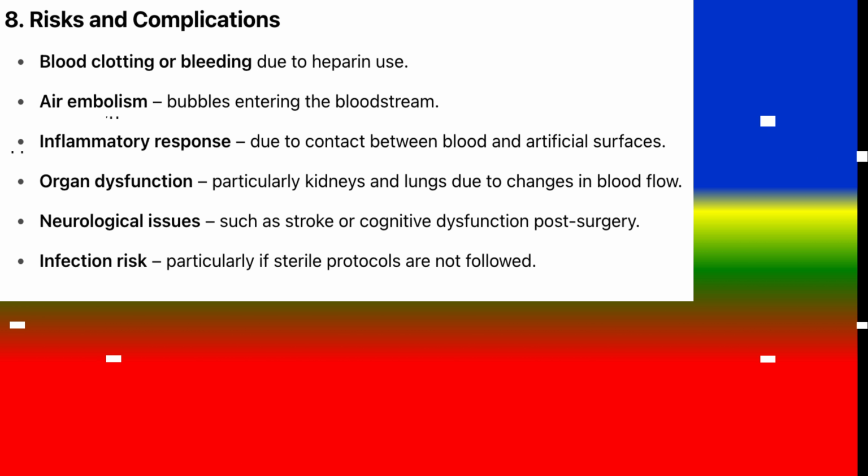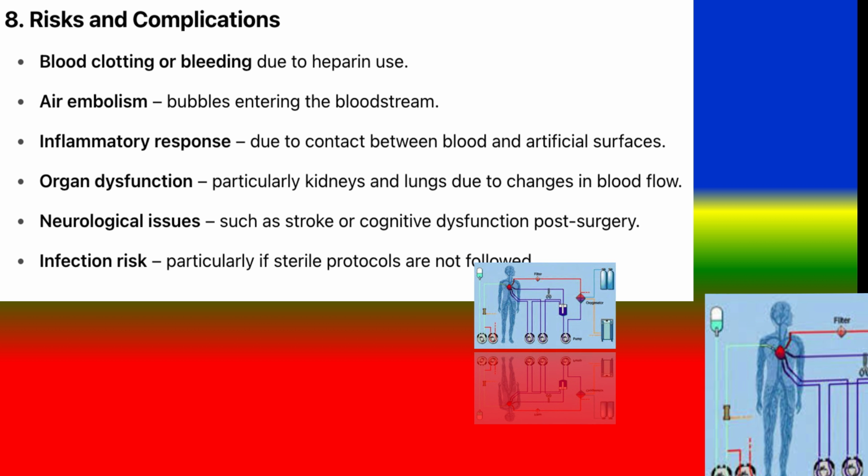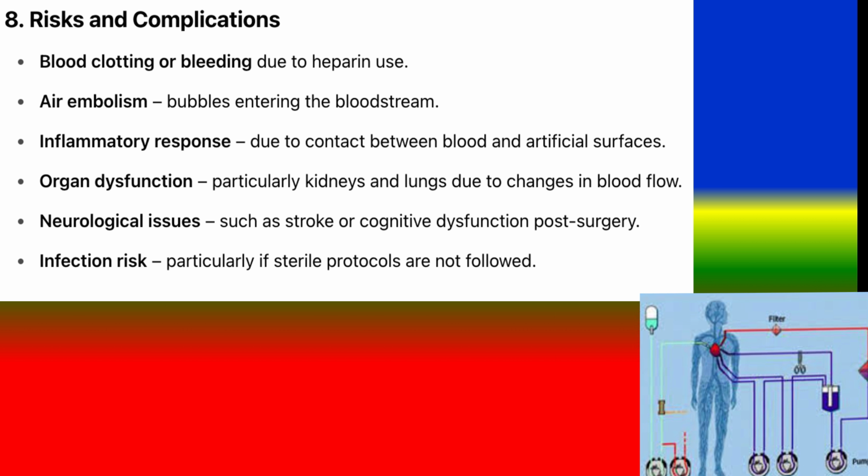8. Risks and complications: blood clotting or bleeding due to heparin use. Air embolism, bubbles entering the bloodstream. Inflammatory response due to contact between blood and artificial surfaces. Organ dysfunction, particularly kidneys and lungs, due to changes in blood flow. Neurological issues, such as stroke or cognitive dysfunction post-surgery. Infection risk, particularly if sterile protocols are not followed.